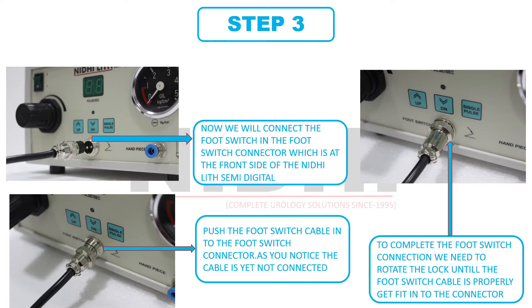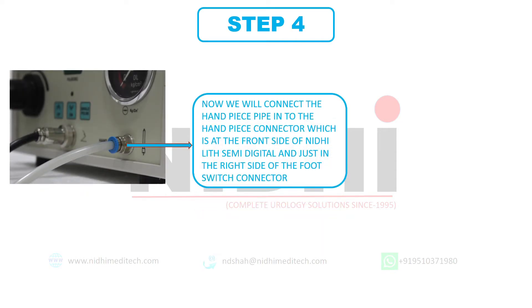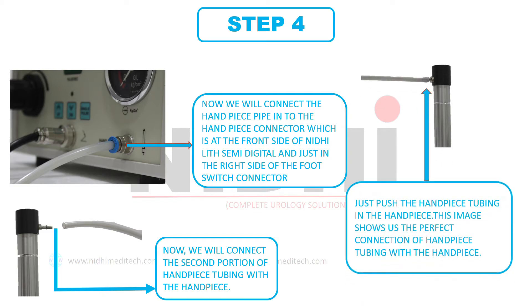Let's move towards step 4. Here we are connecting the handpiece with the control unit. The handpiece connector is at the right side of the earlier footswitch connector. Here we will use the second tubing — the first we have already used in step 1. This handpiece connector is a push-back connector; we simply need to push the handpiece tubing into this connector. Now we need to connect the other portion of this tubing with the handpiece. By gently pushing this tubing into the handpiece, it will connect, and this picture shows the perfect connection of tubing with the handpiece.